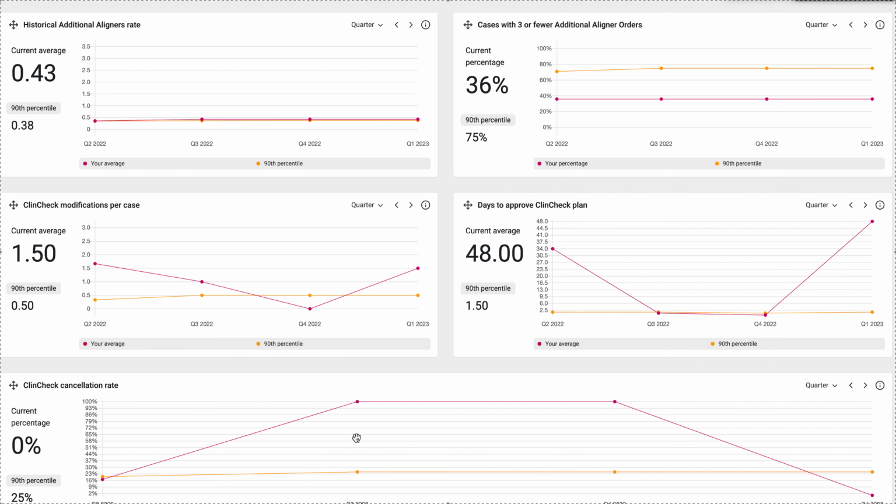If you optimize this using the preferred plan and some type of AI virtual care or virtual care check-in with every aligner, not only can you get your visits possibly down to just 3 and do the rest remotely, you're going to make patients super duper happy with having fewer visits and more efficient and no refinements, hopefully. You should have better outcomes. It's also going to way cut down on your doctor time going back and forth with these Clin Checks.